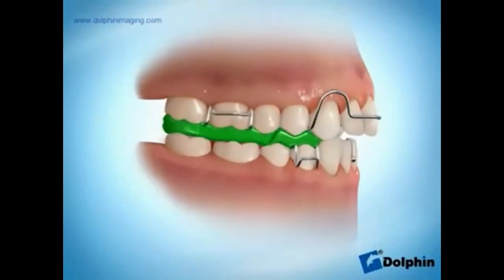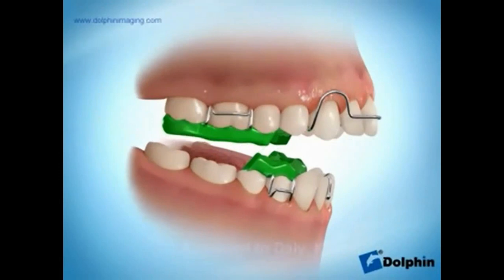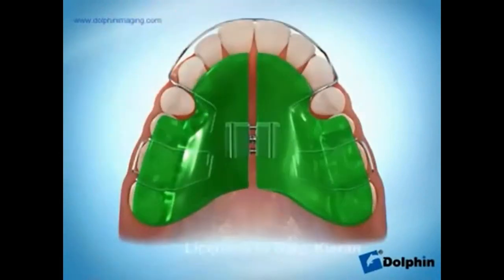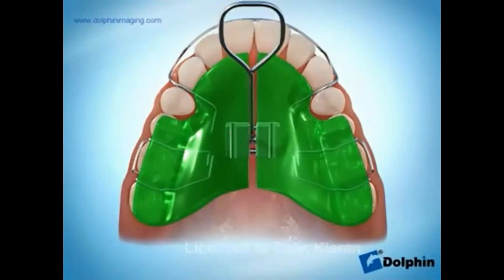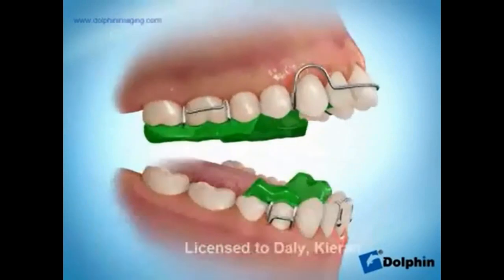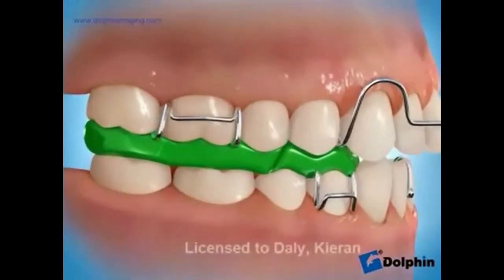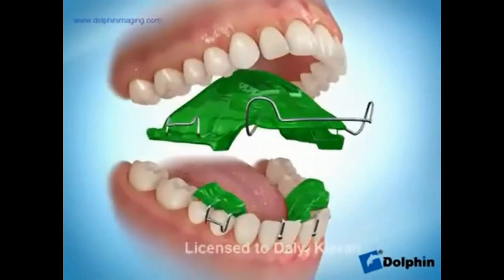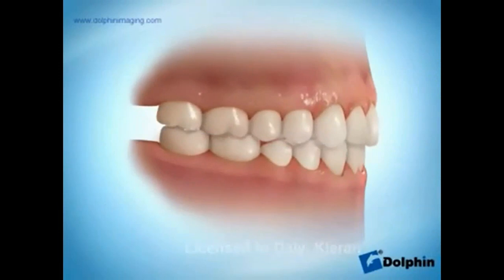Apart from, if you see the incline between the upper and lower blocks, it is also making the mandible bite in a forward position. So we are correcting the jaw bones, but also there is an active expansion screw appliance incorporated in this myofunctional appliance. So it's an active tooth-borne sitting on the teeth myofunctional appliance, growing the jawbone. This is the trimming of the acrylic we are doing, that we do towards the end of the treatment to settle the occlusion once our patient from class 2 has become class 1.